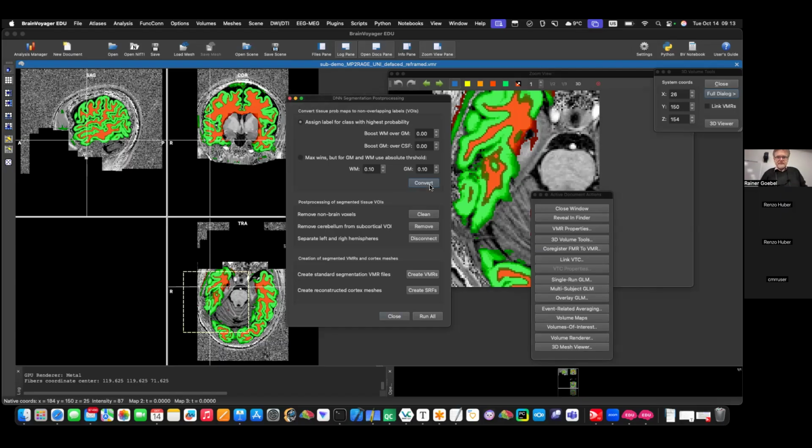So now comes Federico's question, and there are new options. You haven't seen them yet, Federico. There are actually two ways to convert. Normally I don't change it unless I see there's really a bias. In this data, in my opinion, there's no bias. You can just click convert. We can do this in a moment.